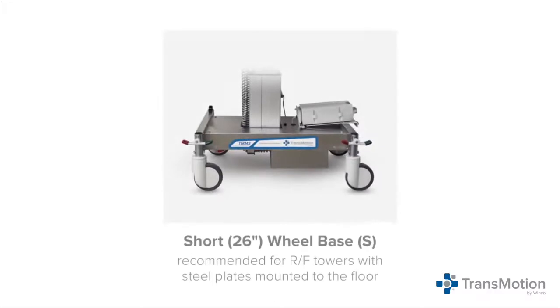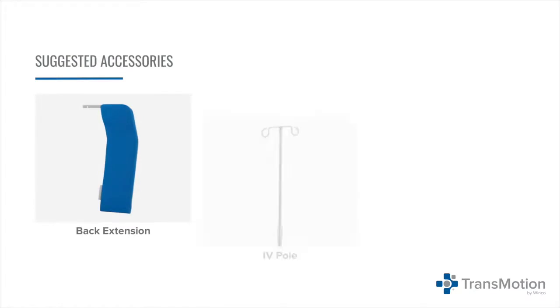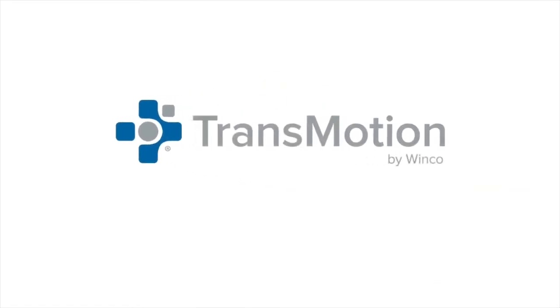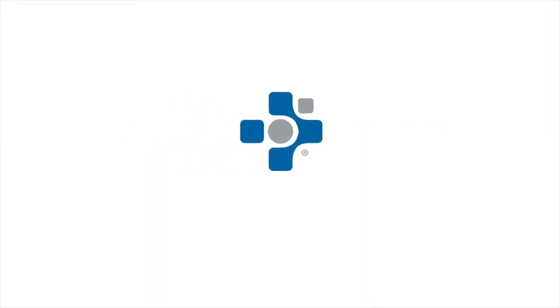A custom short wheelbase of 26 inches or 66 centimeters for RF towers with steel plates mounted on the floor is also available. Key accessories include a back extension, IV pole, oxygen tank holder, and more. TransMotion by Winco — one patient, one surface, from admission to discharge. To speak to a representative, visit us at wincomfg.com.